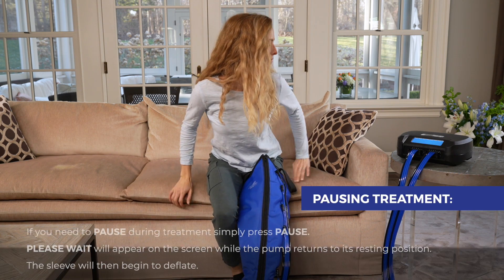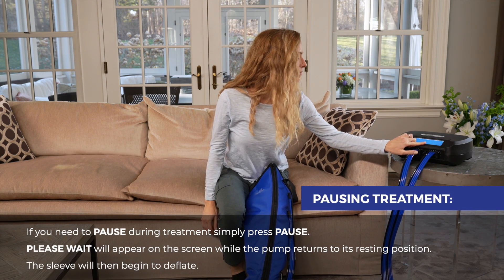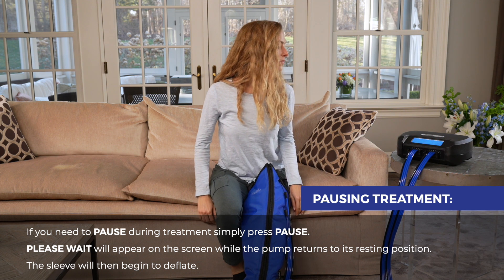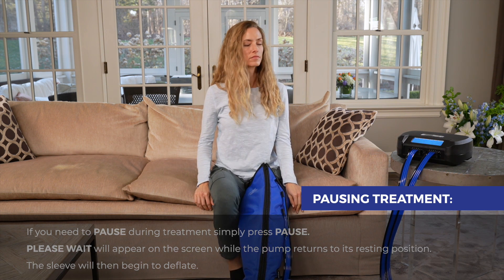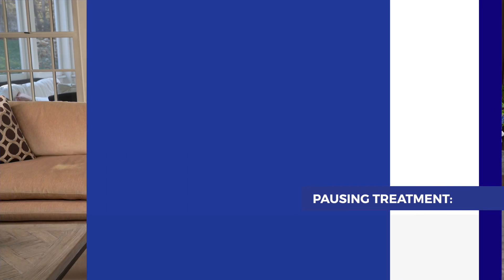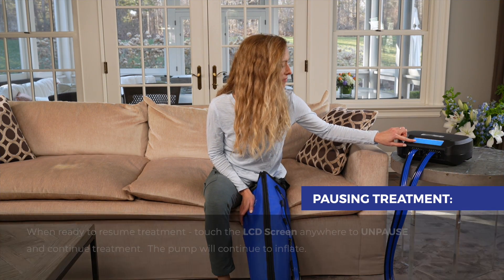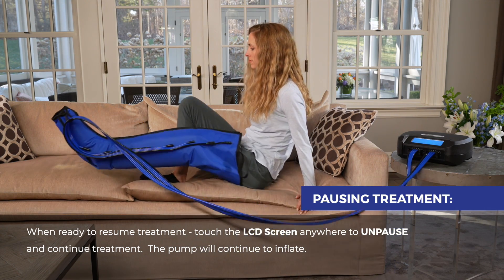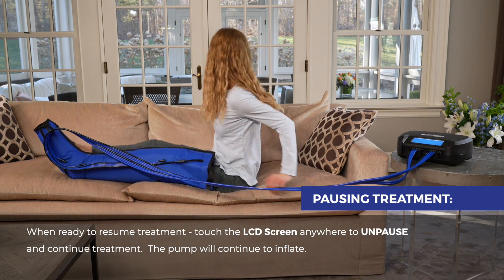To pause during treatment, press pause. Please wait will appear on the screen while the pump returns to its resting position. The sleeve will then begin to deflate. Paused — press to continue will appear on your screen. You may now remove your garment and take care of what you need to do. When ready to resume treatment, touch the LCD screen anywhere to unpause and continue treatment. The pump will continue to inflate.